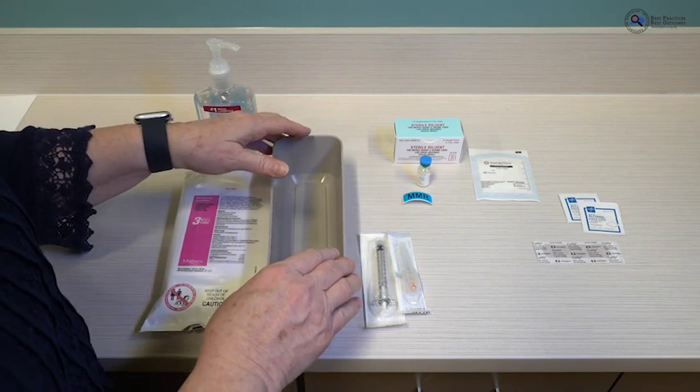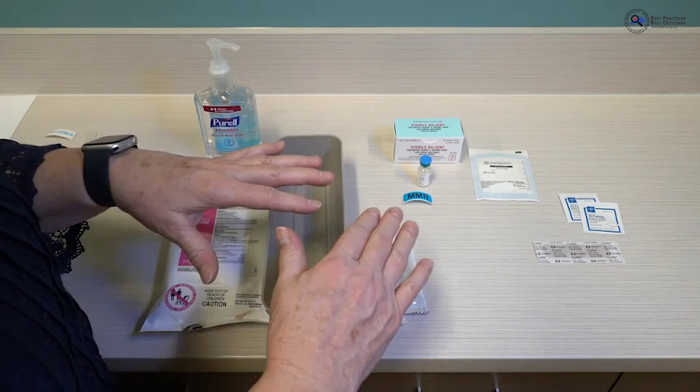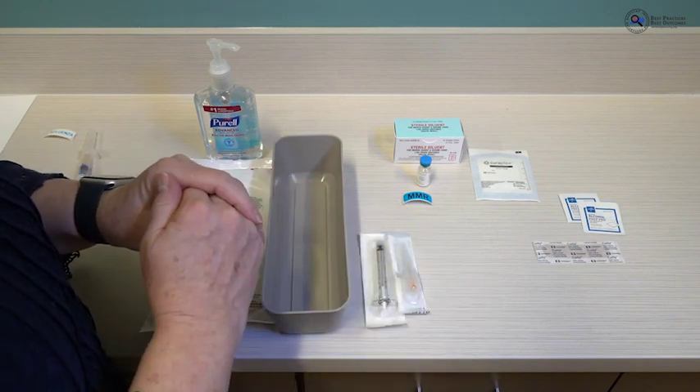Take the vaccine to the site of administration. It's much better than letting it sit on a countertop.